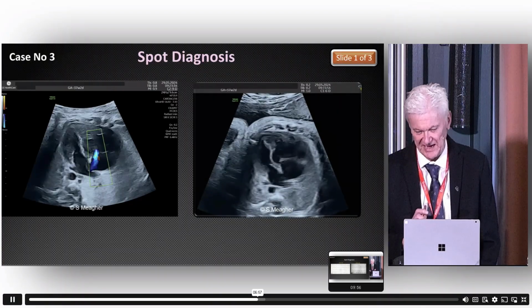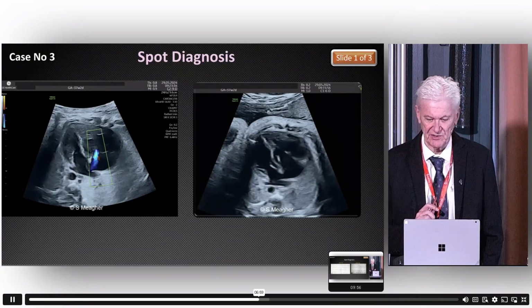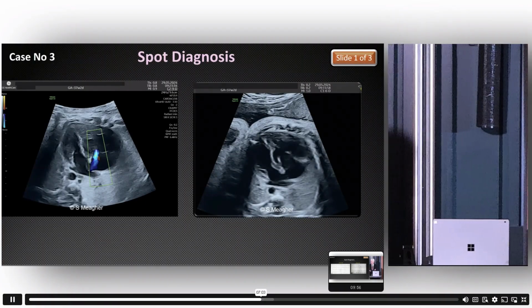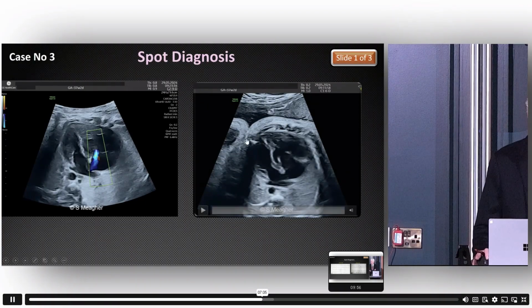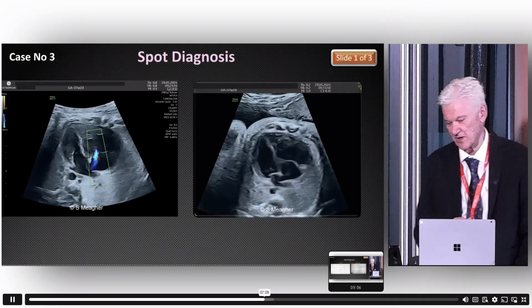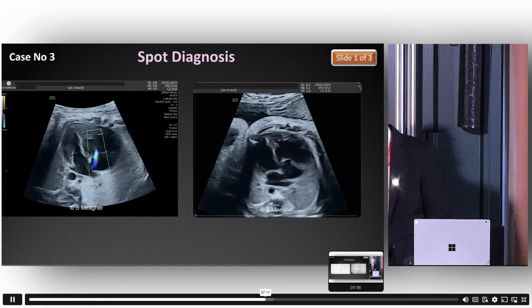And then you move on to a 2D sweep of the same baby, a magnified image, a cardiac setting, increasing your dynamic range. And as you look at that, there's something unusual with regard to that four-chamber. Does anybody want to comment on what the points are? There are 2 points to be concerned about on that four-chamber view of the heart. Well, there's 3 points, actually.